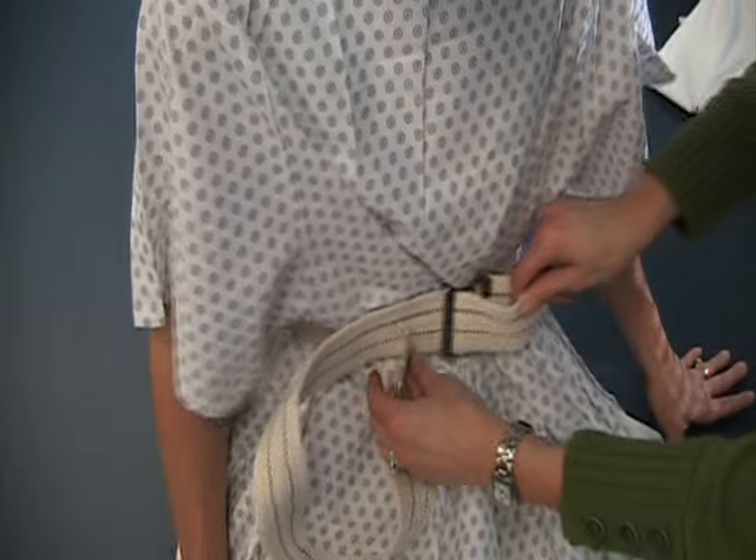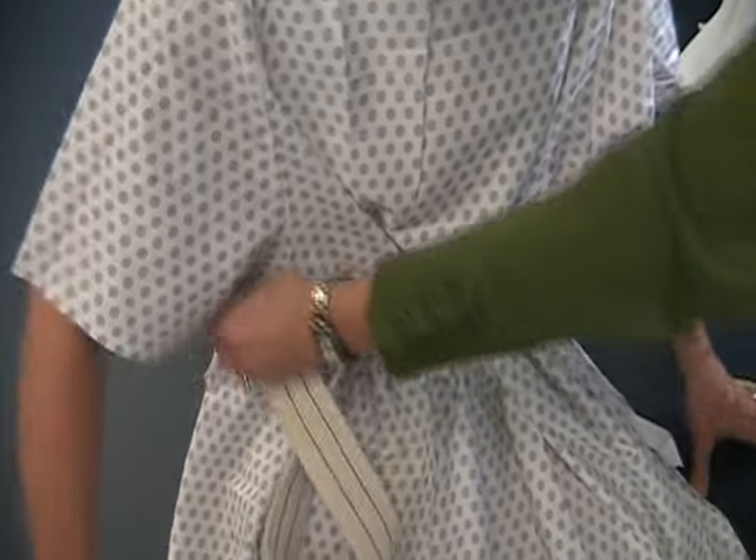It can be tightened, and then the tail can be tucked in the back of the belt.